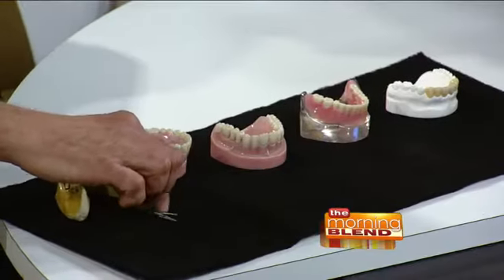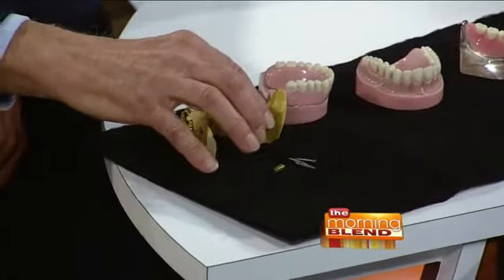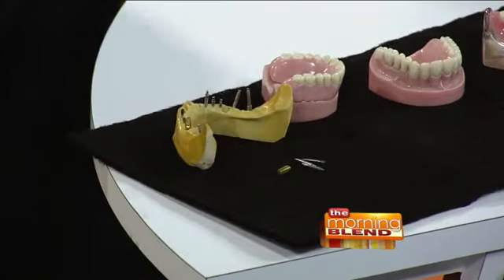One of the things that intrigues people are the mini dental implants, because they're really different from traditional dental implants, right? Somewhat. If you look here, you'll see this is a traditional root form implant, and they're wider than 3 millimeters, and these mini implants, or small diameter implants, are less than 3 millimeters. So quite a bit smaller. Yes, they are. But do they hold as well?